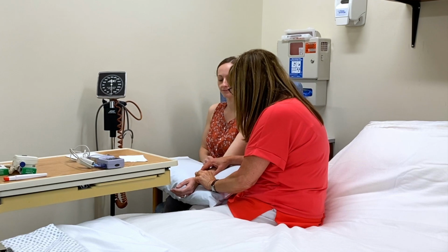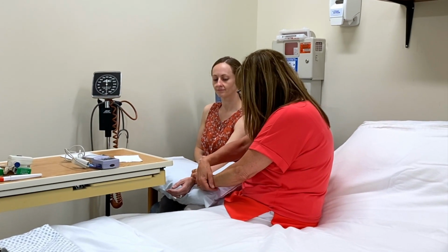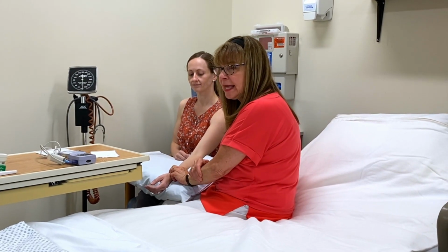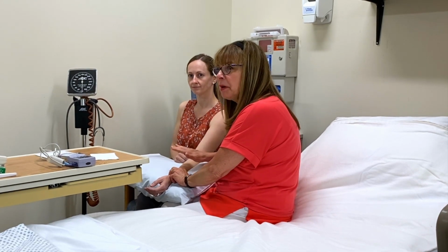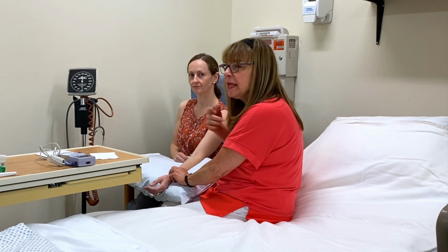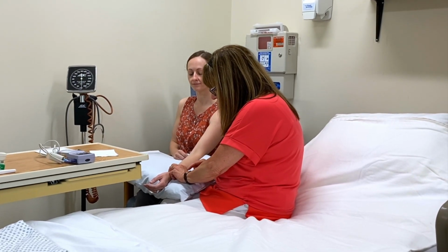And what you want to do first is just find the pulse. And then once you find the pulse, you're going to count for 30 seconds and you're going to multiply by 2. If the pulse is irregular, you need to count for a full minute or listen to it apically directly over the heart. So I'm going to count now.